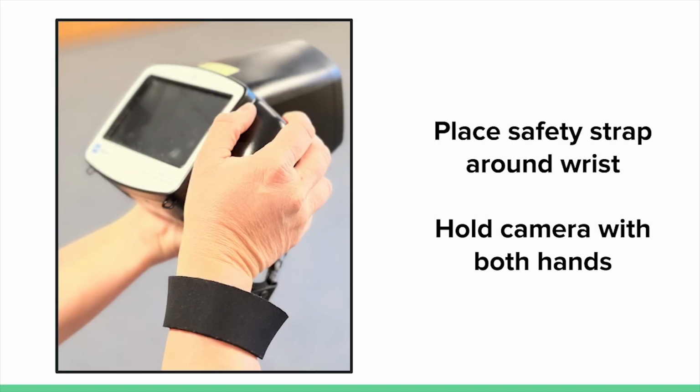When holding the Spot screener, place the safety strap around your wrist. While conducting a screening, hold the device securely with both hands. If you are not actively using the Spot screener, please place the device back in the case.